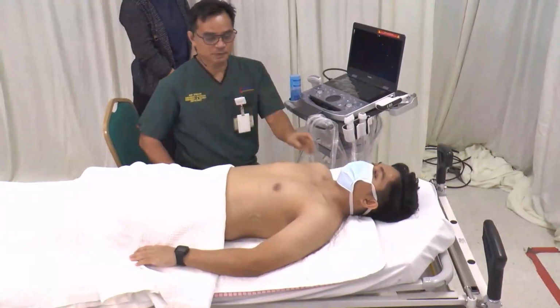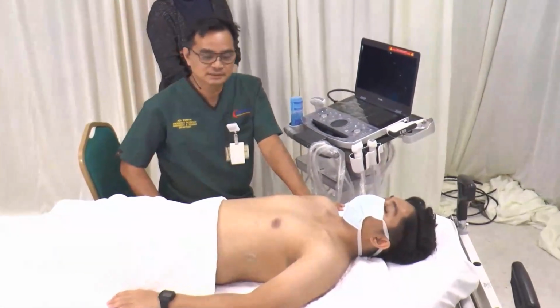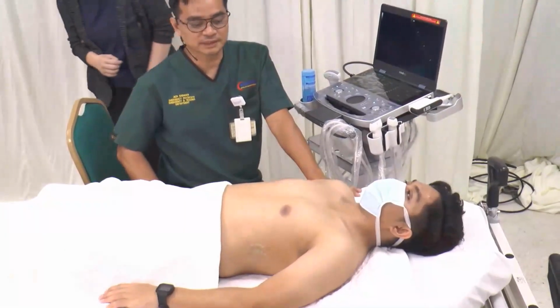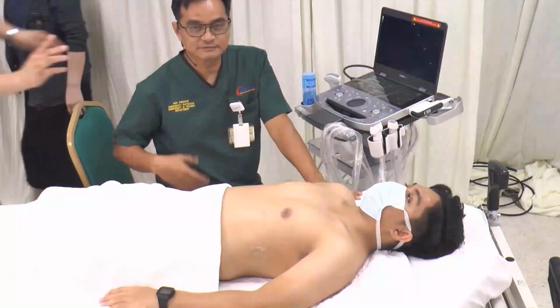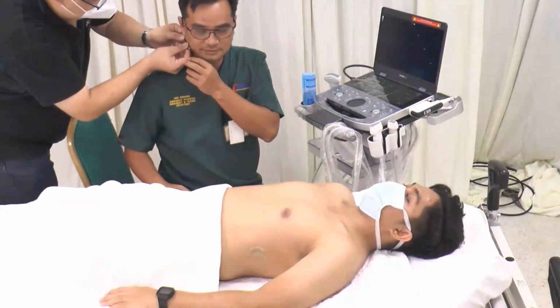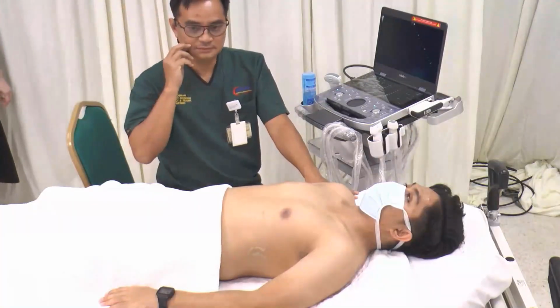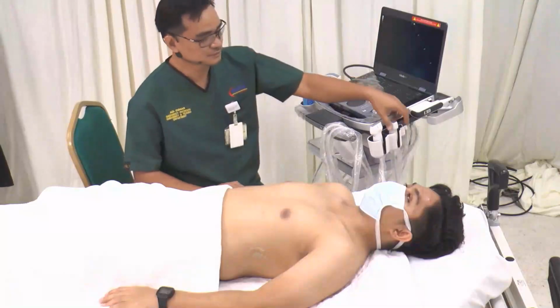Since we probably have a lot of beginners in focused ultrasound, in the first part of my demonstration, I will show how to get a view that I find very difficult. Adi, may I just suggest we keep it simple and keep it qualitative. All right.